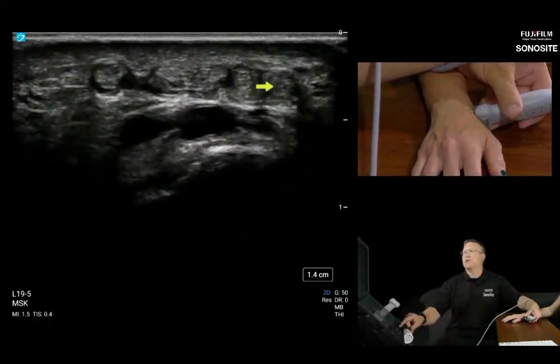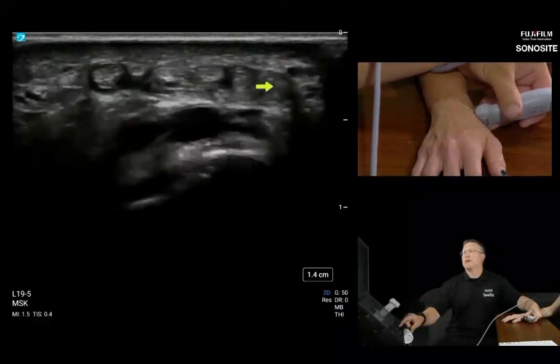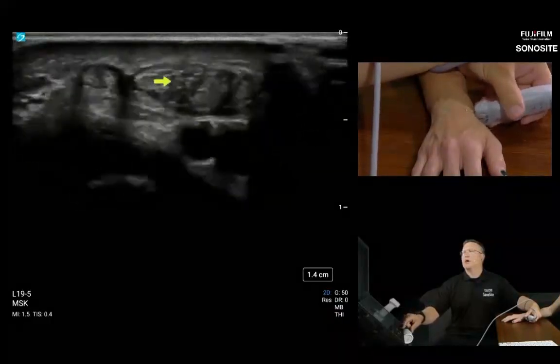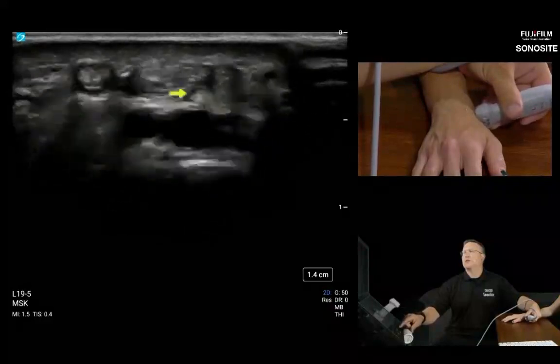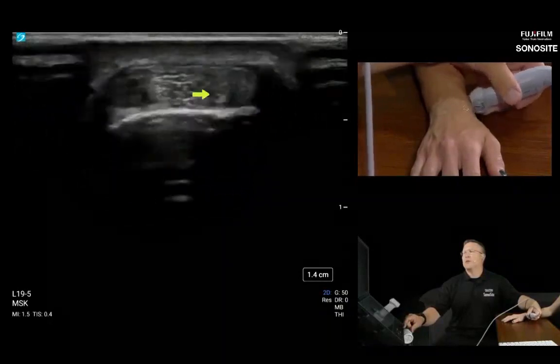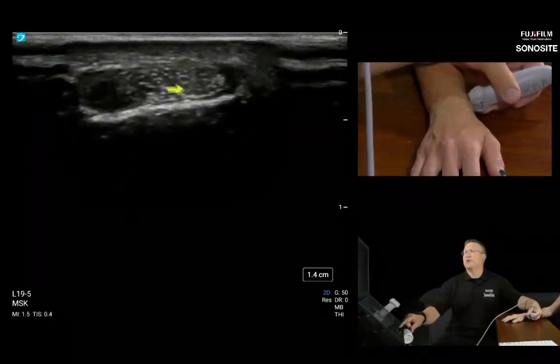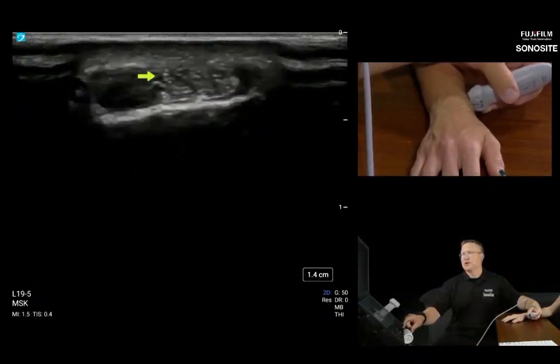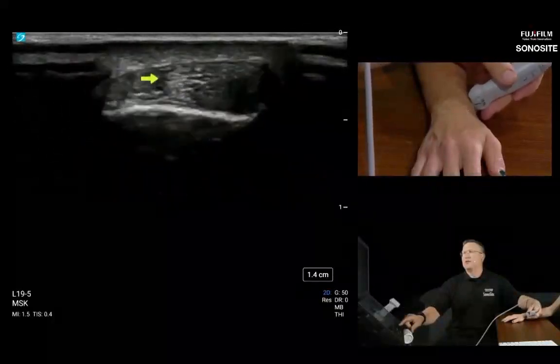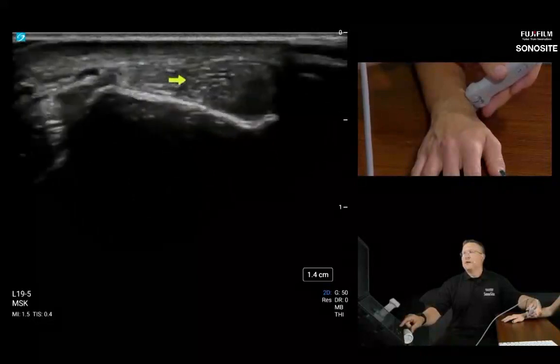So we had this bundle already showing itself of about 1, 2, 3, 4 individual tendon slips, maybe a fifth one right here. So in some of the patient population, right at the compartment level, you can already see those group up, and you just don't want to call it tendinosis. You don't want to call it longitudinal split tearing or anything like that. And then we'll go long axis.